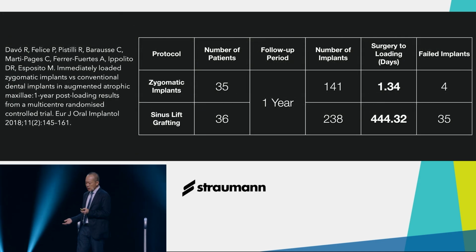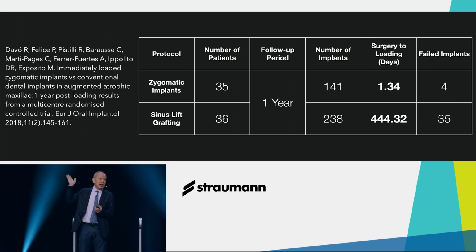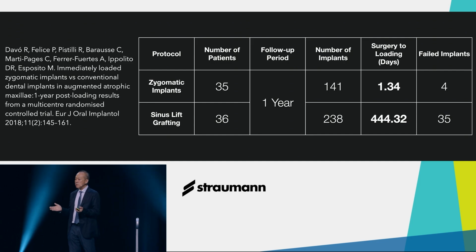And another study by Davó and his co-workers also demonstrates the significance of immediate loading, because if we look at the time from surgery to loading, if we are using zygomatic implants, we are talking about on average 1.34 days. But if we are doing bilateral sinus lift grafting, then it takes over a year before we can provide the implant rehabilitation.